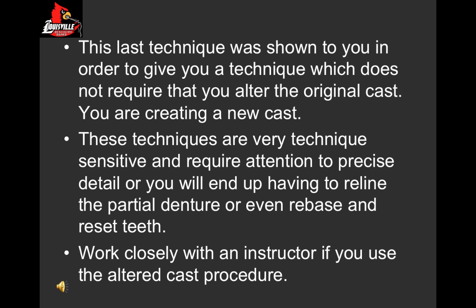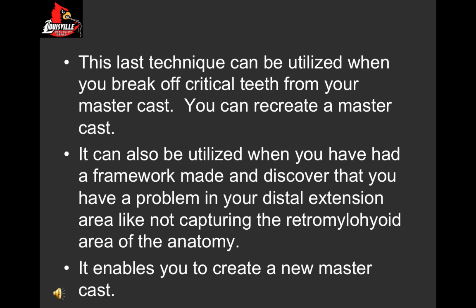Do not hesitate to get some help from an instructor if you have any questions, please. This last technique can be utilized when you break off critical teeth from your master cast. It enables you to create a new master cast by using this technique.